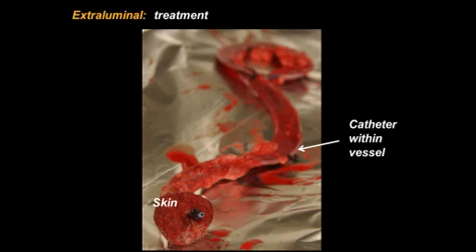So let's take a look at the vessels themselves. And here, when the animal was euthanized, then we did an en-bloc dissection in which we took the entire catheter within the tissue, including the skin, the sub-Q space, as well as the vessel all of the way to the right atrium. Here you can see the catheter within the vessel, and it almost looks like it's outside, but know that the vein wall is transparent and you can see through.